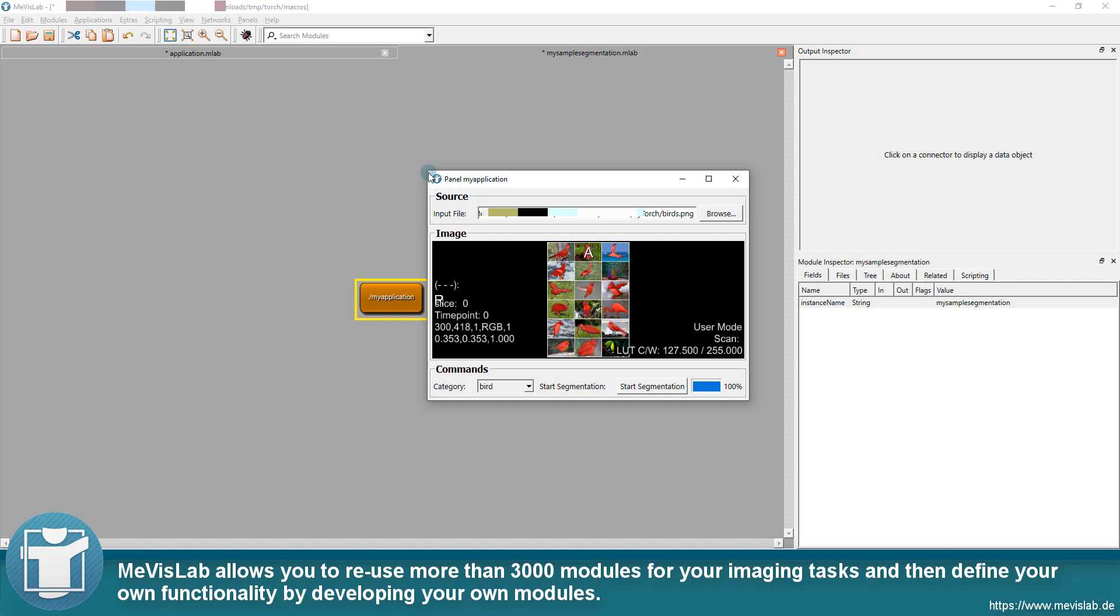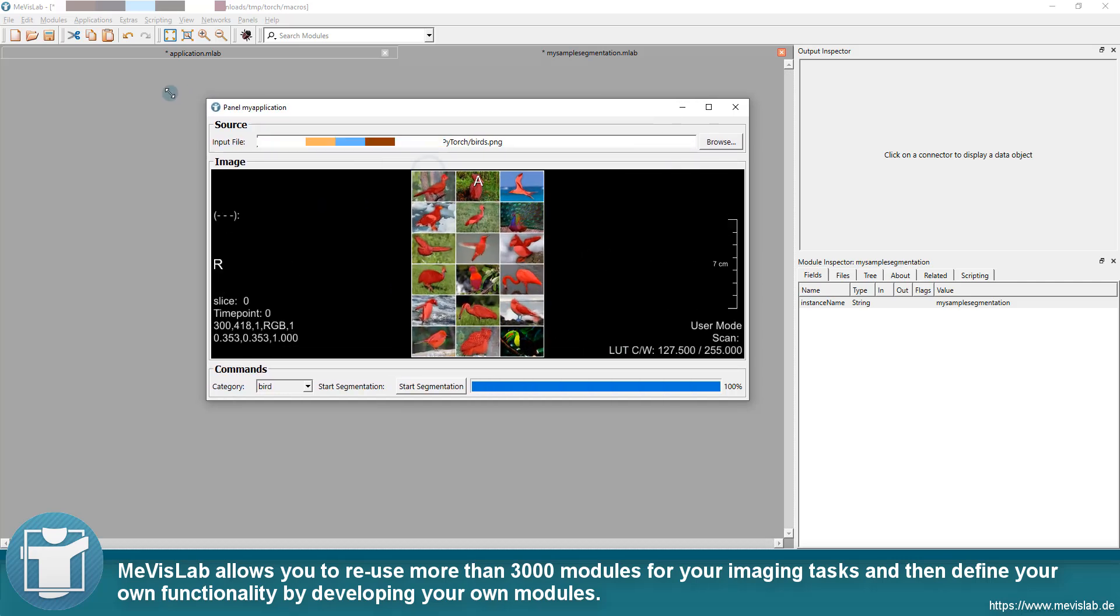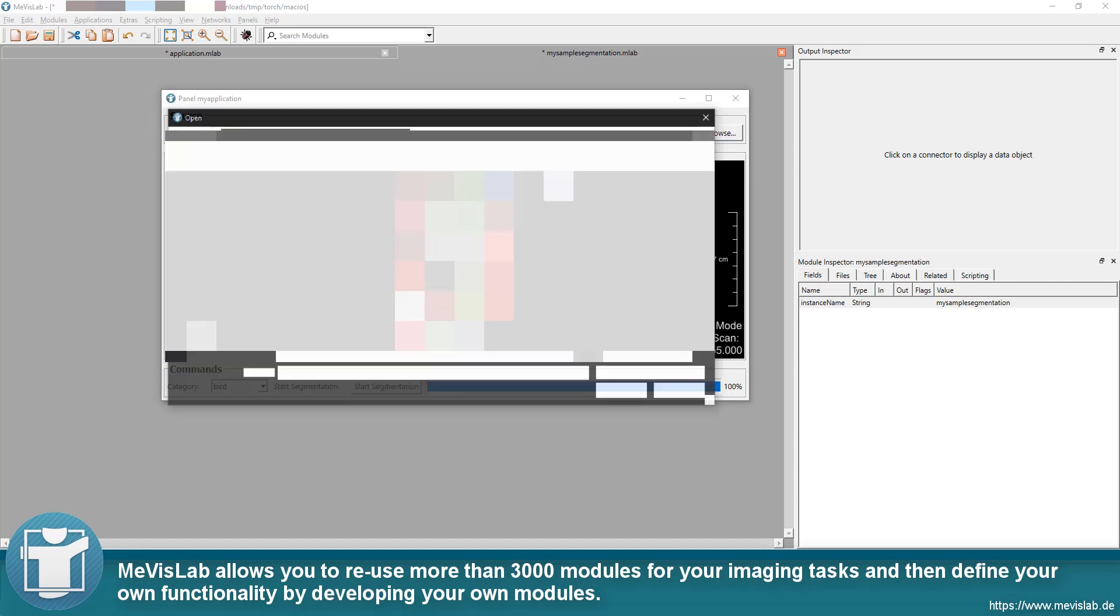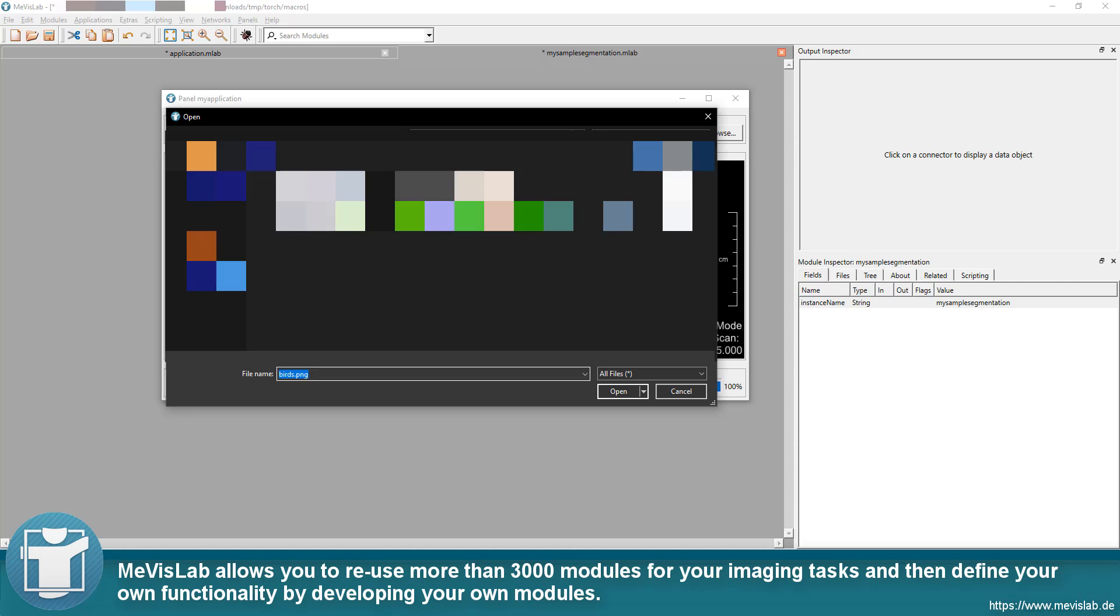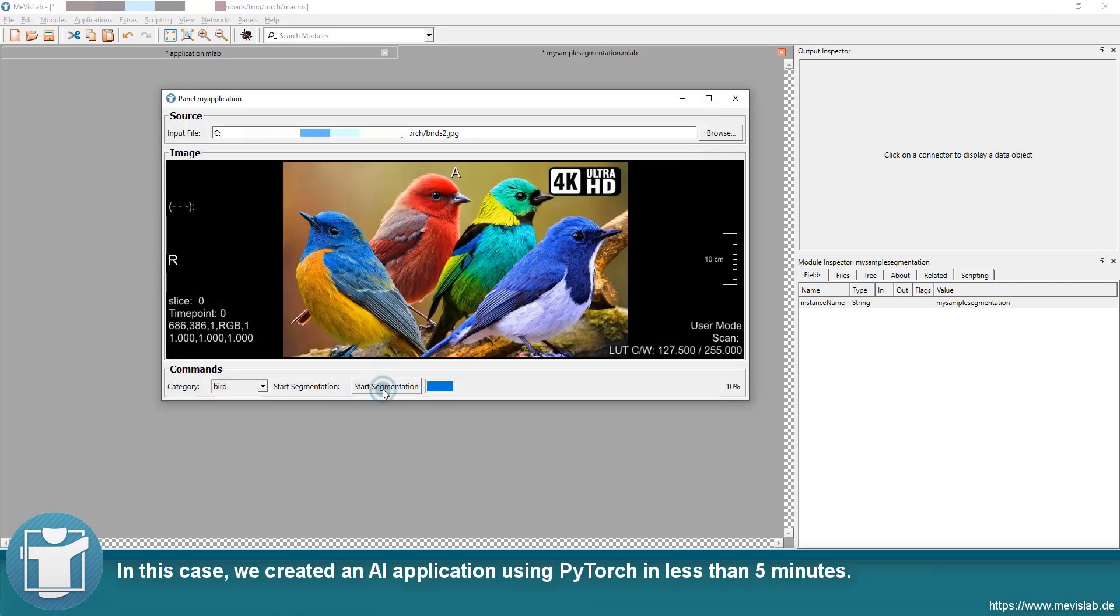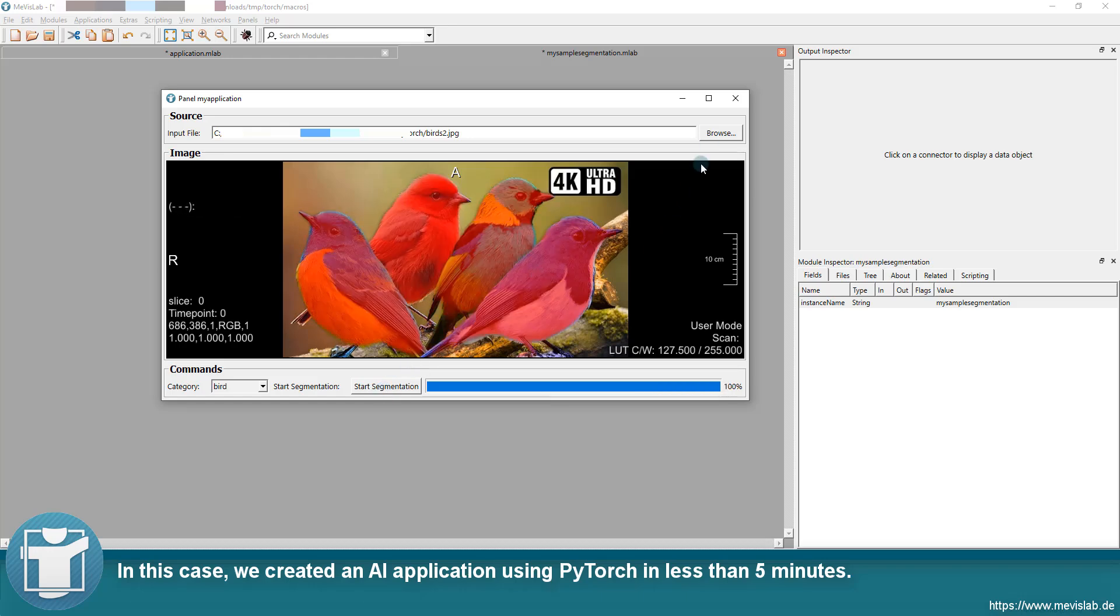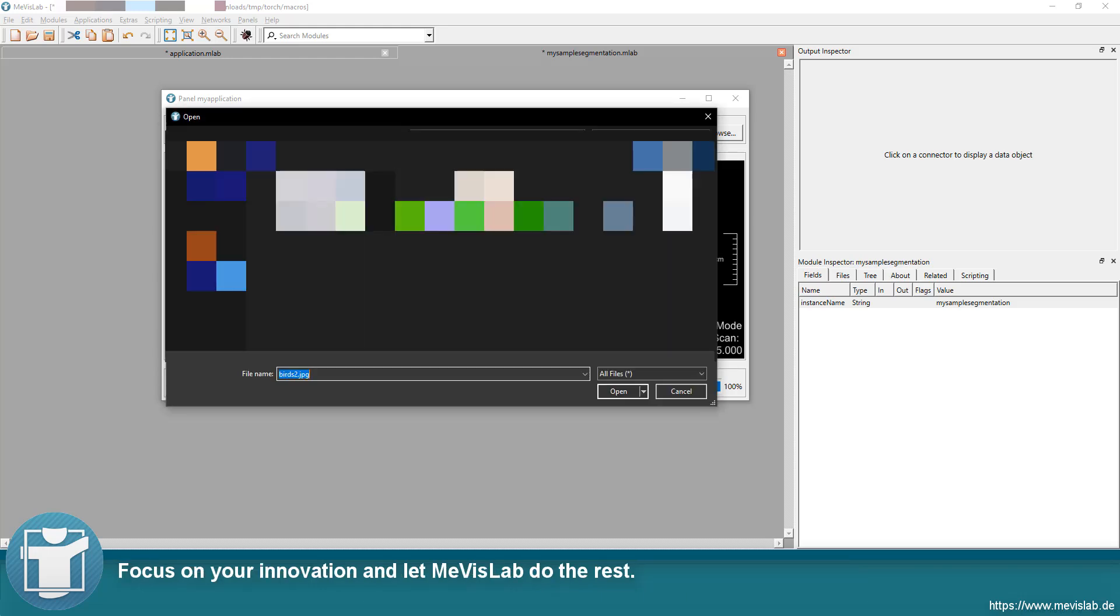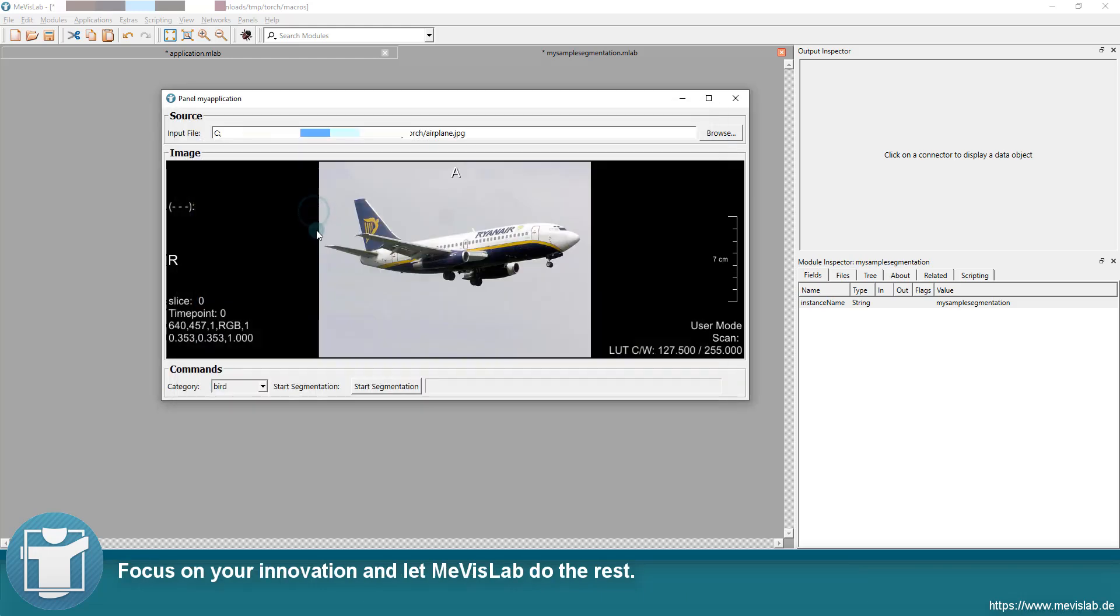Mevislab allows you to reuse more than 3000 modules for your imaging tasks and then define your own functionality by developing your own modules. In this case, we created an AI application using PyTorch in less than 5 minutes. Focus on your innovation and let Mevislab do the rest.